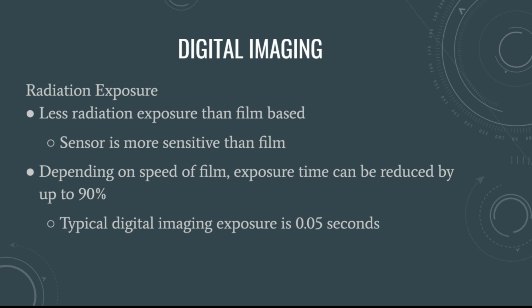A typical digital imaging exposure is 0.05 seconds. 0.05, that's not even one whole second to create a radiographic image. So this also means that it reduces the absorbed dose for the patient.